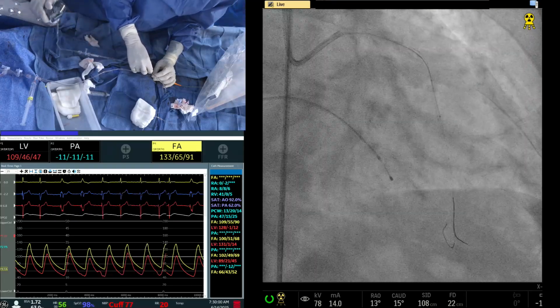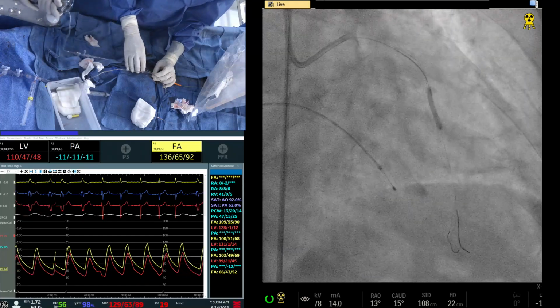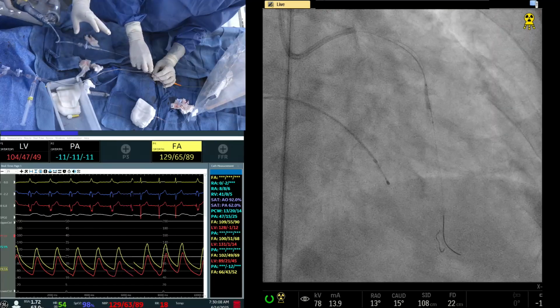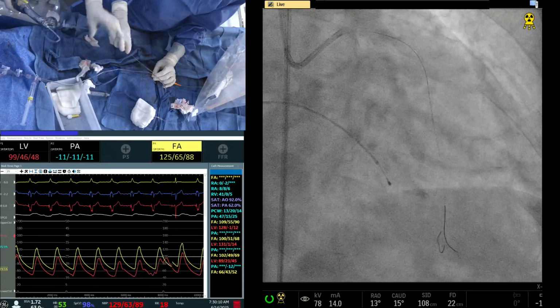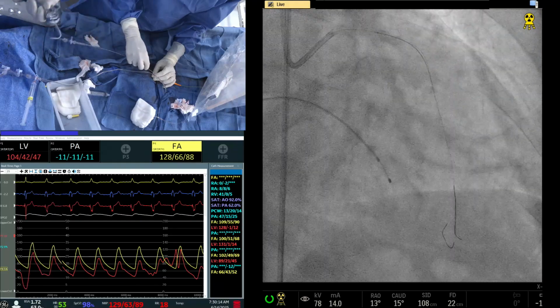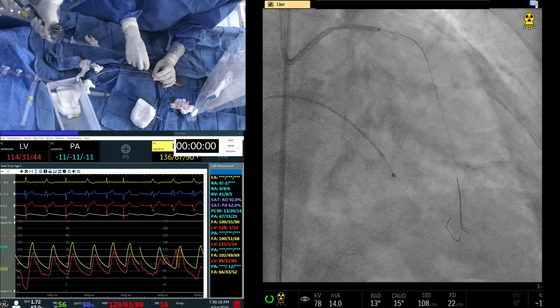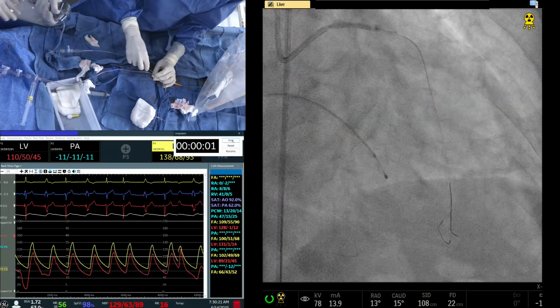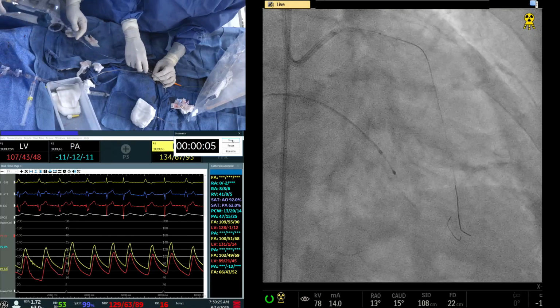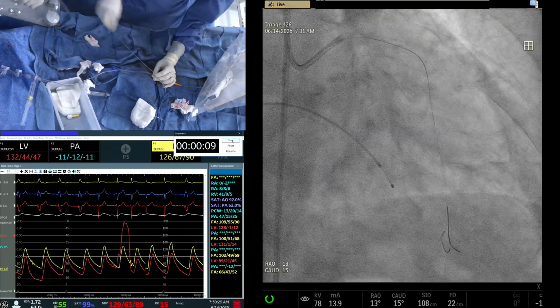Okay, good. And then you have to open the ostium a little bit, because the burr doesn't work. It's 20 millimeter down. 33 is good or 38? Below the ostium of the diagonal there is a long lesion, so landing zone is way down. In this case, using a 38 also is not a big deal. It's not going to get any bypass surgery, even if there is restenosis. 2.5 by 38. Yeah, good. Okay.